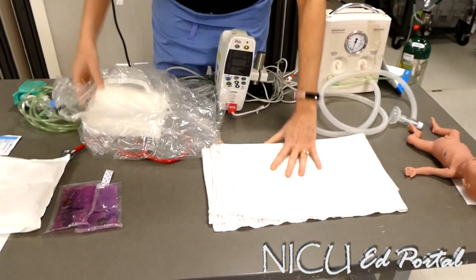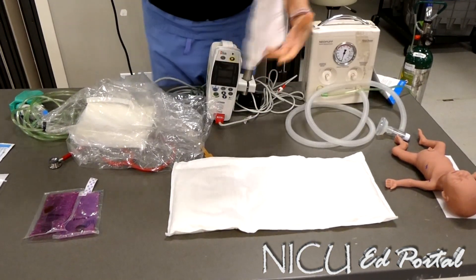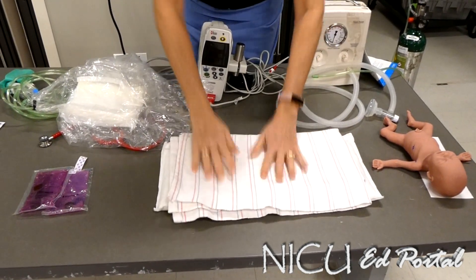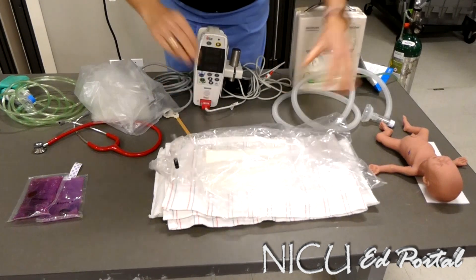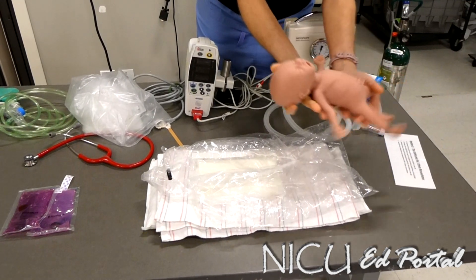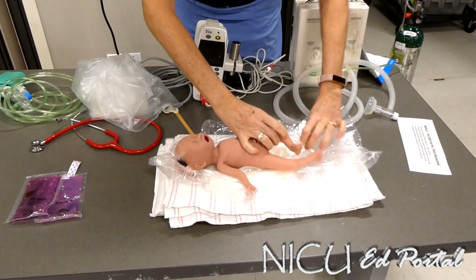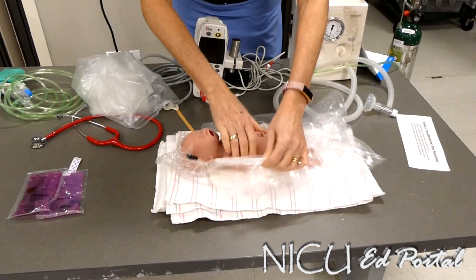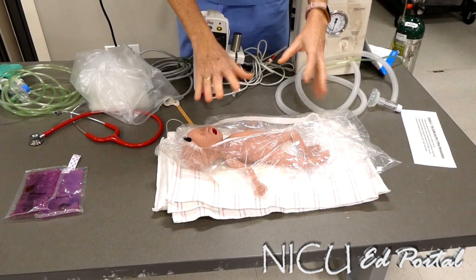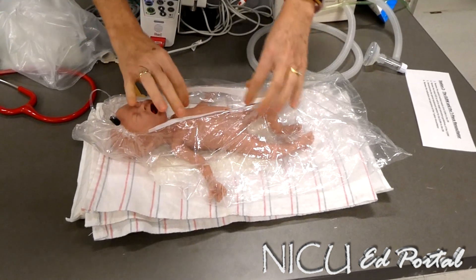Let's say baby's not born yet. The NICU gets the opportunity to put the heat warmer down so this is nice and warm. Never put a baby directly on the heat warmer — we've got a blanket in between. The bag is positioned, the OB delivers the baby, and the baby comes over to us with the appropriate tone. Baby goes immediately into the bag. The amniotic fluid that is on the baby is warm, which keeps the baby warm for transport and for resuscitation.